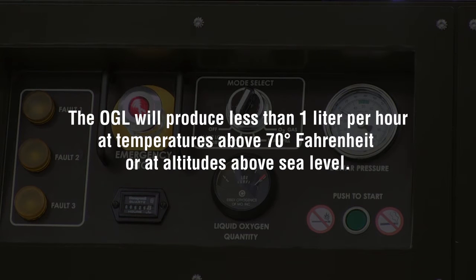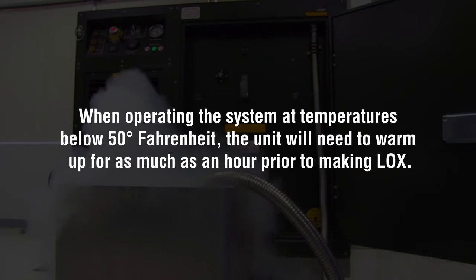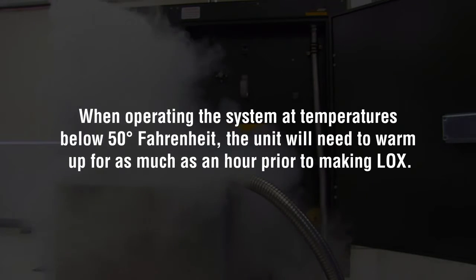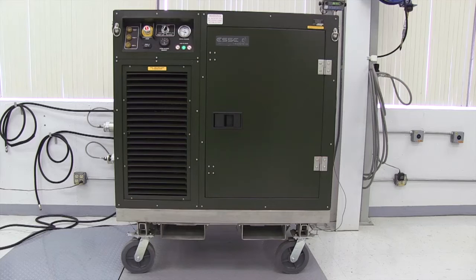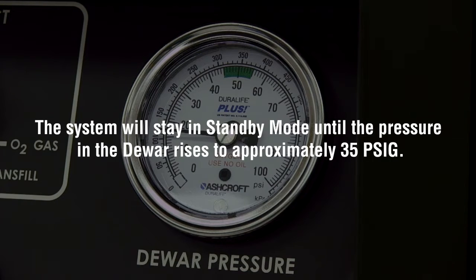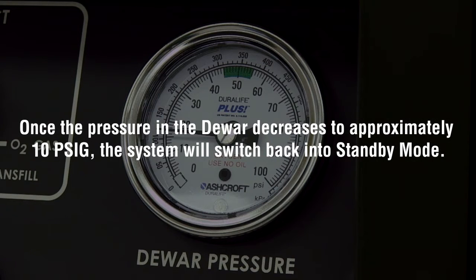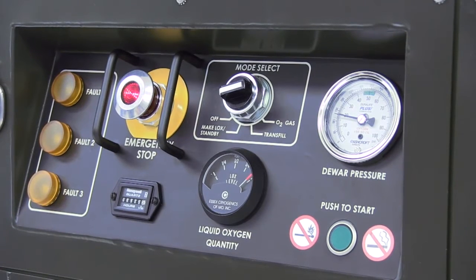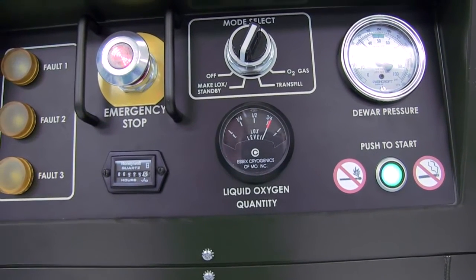The OGL will produce less than one liter per hour at temperatures above 70 degrees Fahrenheit or at altitudes above sea level. When operating the system at temperatures below 50 degrees Fahrenheit, the unit will need to warm up for as much as an hour prior to making LOX. When the dewar reaches capacity, the system will go into standby mode to maintain the volume of liquid oxygen. The system will stay in standby mode until the pressure in the dewar rises to approximately 35 PSIG, then revert to make LOX mode to reliquify the gas. Once the pressure decreases to approximately 10 PSIG, the system switches back into standby mode, cycling to maintain zero loss of LOX from the dewar. While in standby mode, the system operates for 15 to 20 minutes every two to three hours.